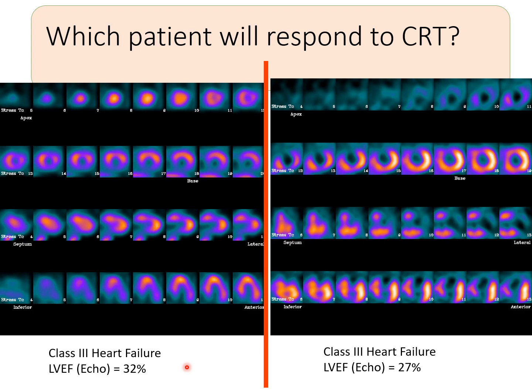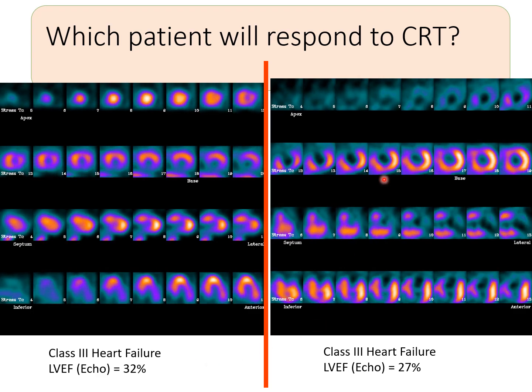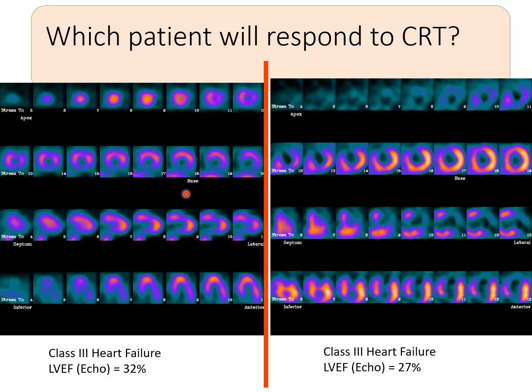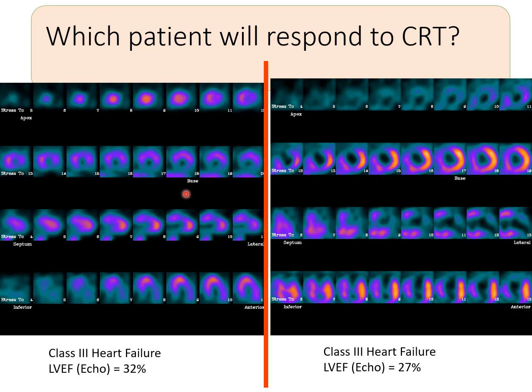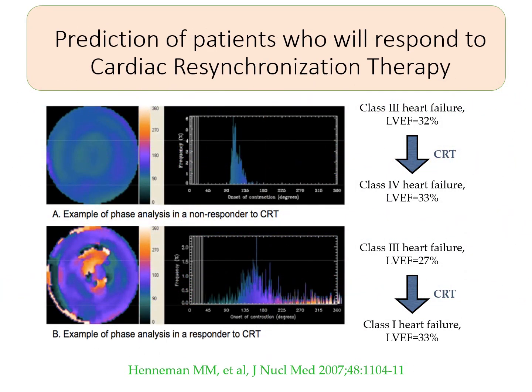So you can note visually this patient is quite dyssynchronous, whereas this patient is significantly more synchronous, even though it has a low EF. So what happens? This is the pre-CRT histogram, and for the patient that you saw before that looked more synchronous, this is the one where it looked dyssynchronous, and so the histogram reflects what you saw with your eye, but in a quantitative way.